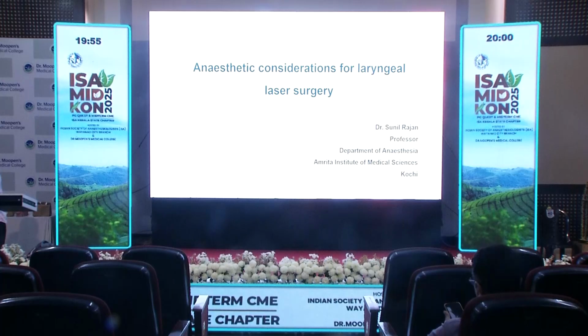The topic of my talk is anesthetic considerations for laryngeal laser surgery. As we all know, laryngeal laser surgery offers enhanced precision during surgical procedures, and it minimizes intraoperative bleeding. It also improves therapeutic outcomes for vocal fold lesions, and is commonly used for treating conditions like papilloma and polyps. However, it requires close coordination between the anesthesiologist and the surgeon.